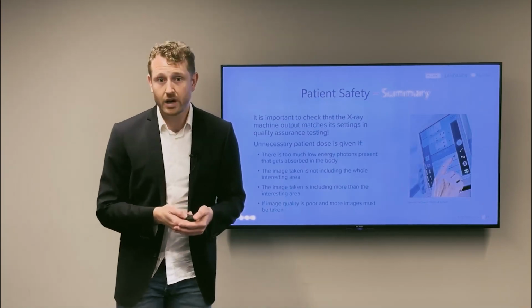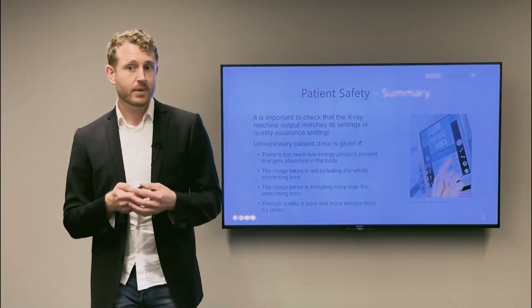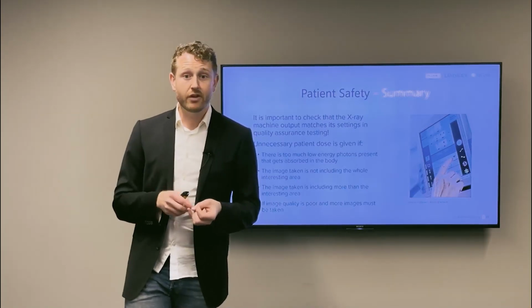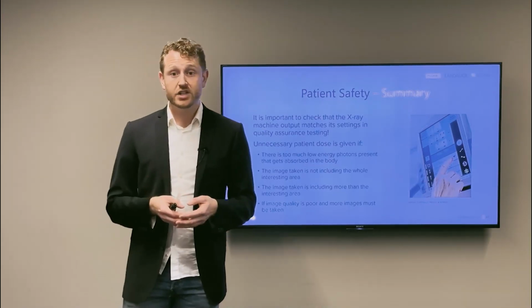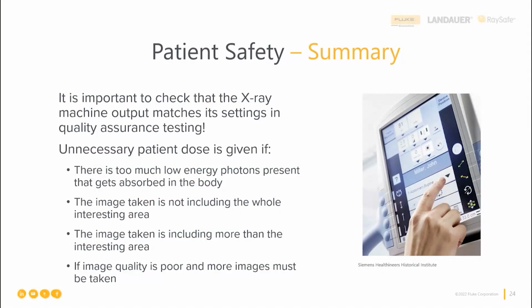One should always strive towards getting as good image quality as possible without giving the patient unnecessary dose, all in accordance with ALARA. Unnecessary dose is given if there are too many low energy photons present that get absorbed in the body, or the image taken is not including the whole interesting area, or the image taken is including more than the interesting area, or if the image quality is poor and more images must be taken.